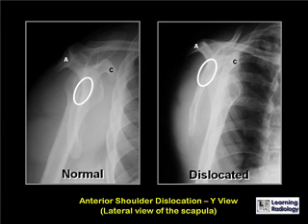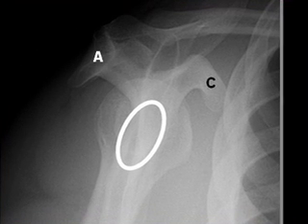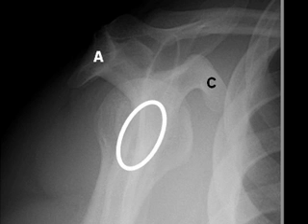This is a Y view of the shoulder — a lateral view of the scapula. On this normal Y view, you can see that the glenoid, marked here by the white oval, lies midway between the posterior acromion, marked with an A, and the anterior coracoid process, marked with a C.